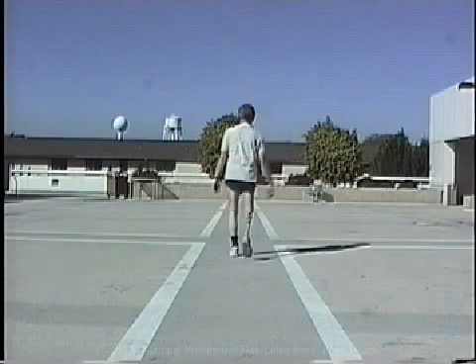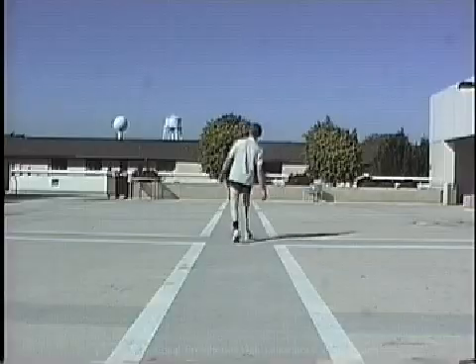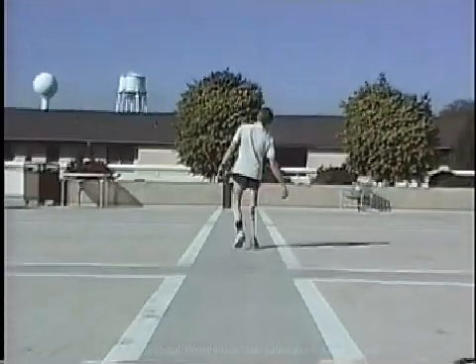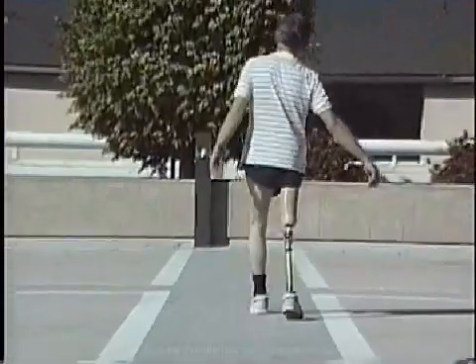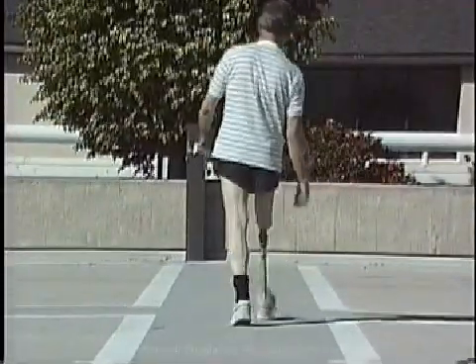Lateral trunk bending is characterized by a significant leaning of the torso toward the prosthetic side. This deviation occurs at mid stance and is best viewed in the coronal plane.